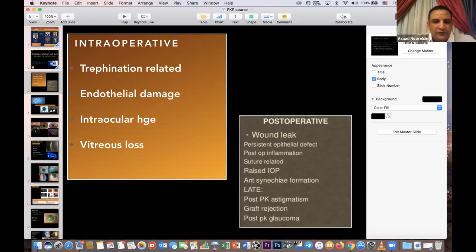We can avoid the vitreous loss by decreasing the intraocular pressure before surgery. Good preparation before surgery, by application of mannitol, a hyperosmotic agent, and acetazolamide, which decrease the intraocular pressure. Good preparation of the patient before surgery can avoid these complications. I can also use a loose, soft speculum, and good anesthesia by the anesthesiologist. Good anesthesia can make the patient relax and the intraocular pressure quiet. All these precautions can be done before and during surgery to avoid the intraocular hemorrhage.